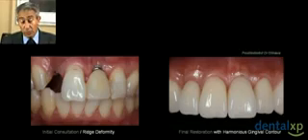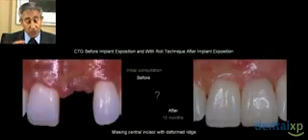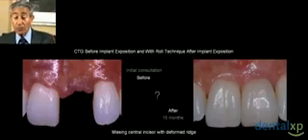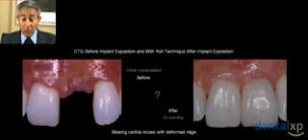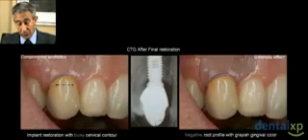By going to the tuberosity, we take a large piece that we cut in two pieces, and we are going to plug each piece in the depressed ridge. And you can see, after the work of Dr. Okawa, who is a fantastic restorative dentist, we have a beautiful result with harmonious contour and bulky contour. So we change the biotype by adding connective tissue grafts.